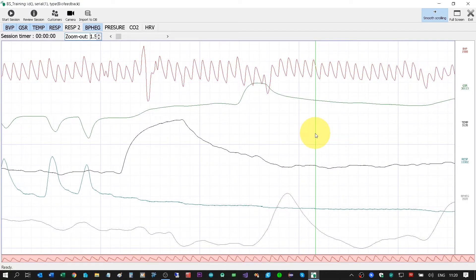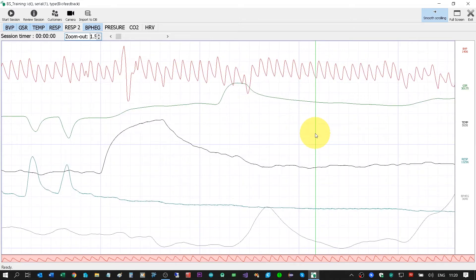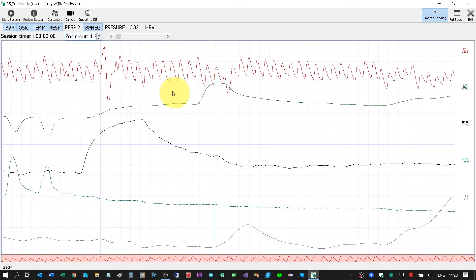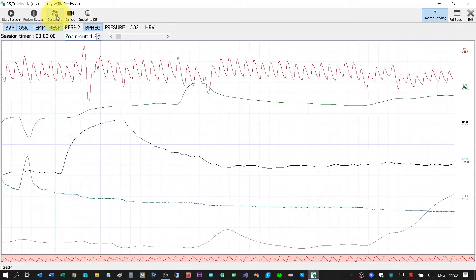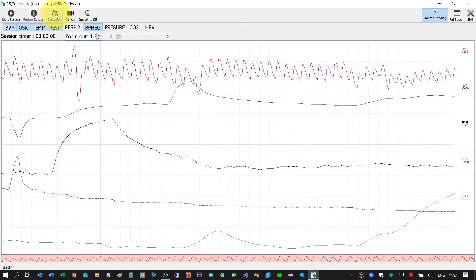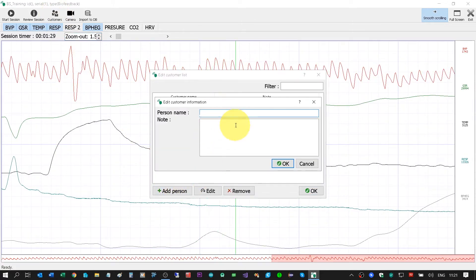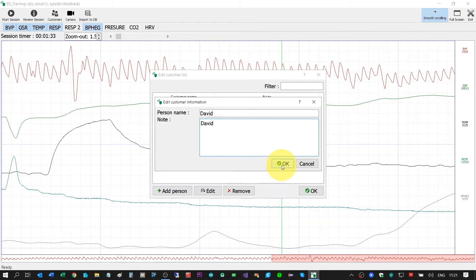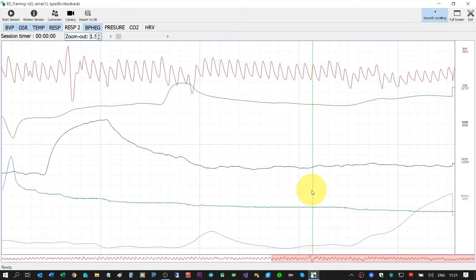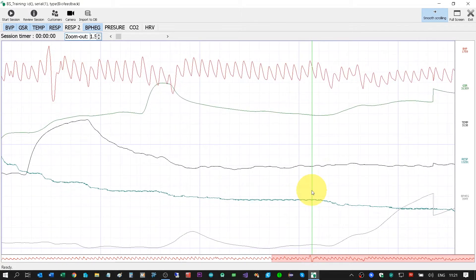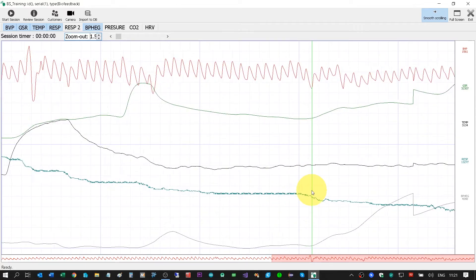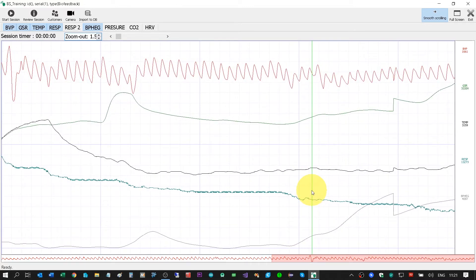If I would like to do a training, first of all I must add a customer. I will click here on this button — Add a Person. Let's say the name is David for this example. Okay, we have David. Now we can start doing the training.